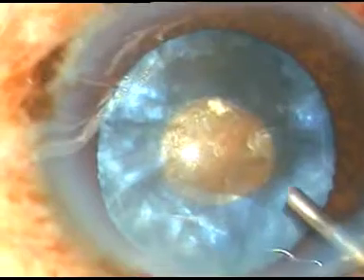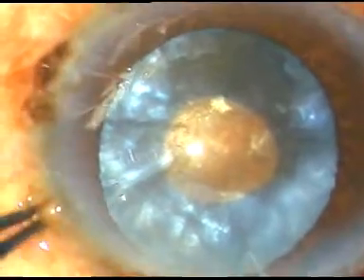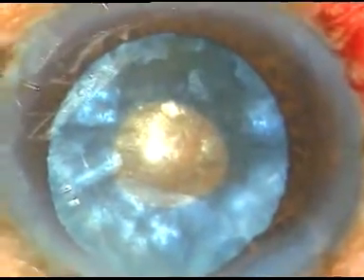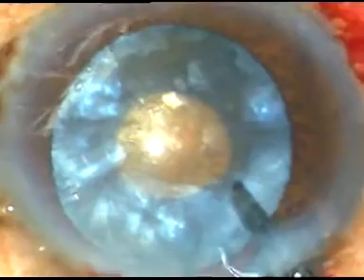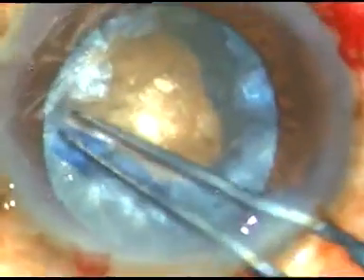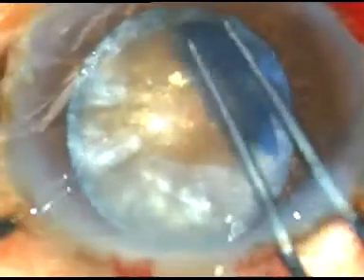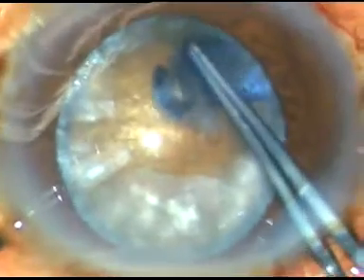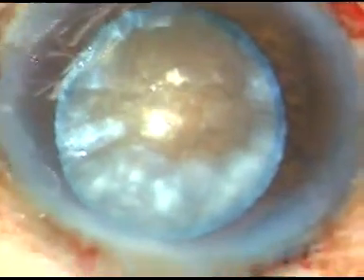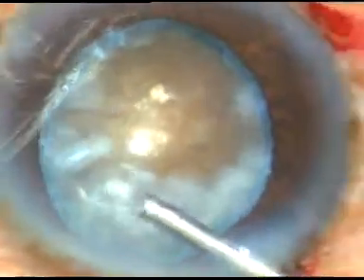Viscoelastic substance is then injected again. A Vannas scissor is taken and a small nick is made at the margin of this small rhexis. The utrata forceps is taken again, this tag is held, and in this case I'm going to do a large rhexis because I can see there is a hard brown big nucleus. I'm going almost along the border of the pupil and I have made a large rhexis. This will facilitate management of this hard nucleus.